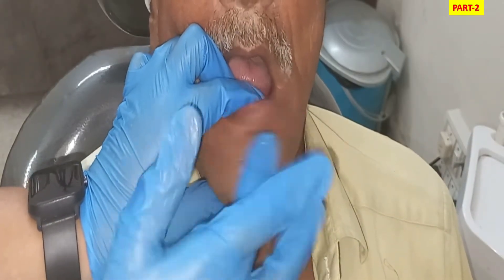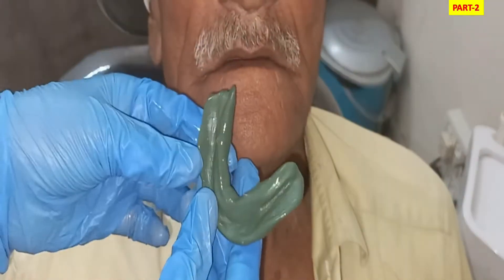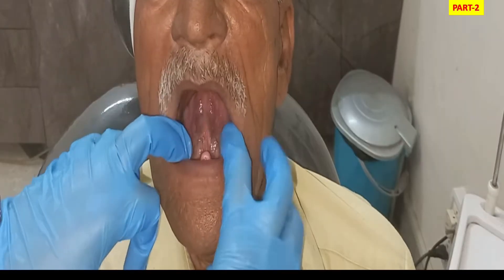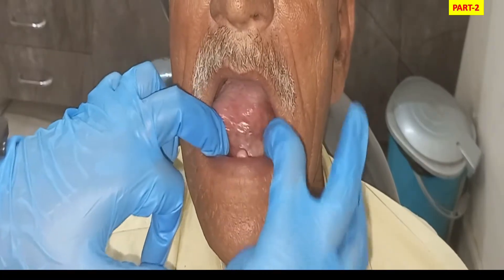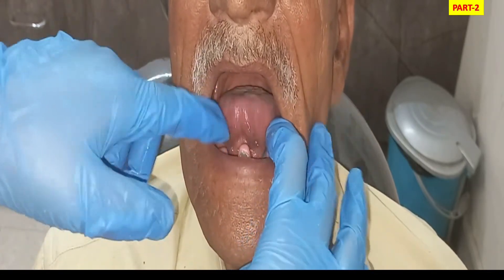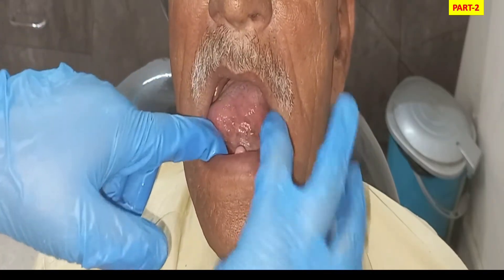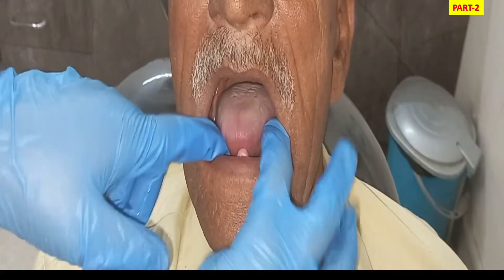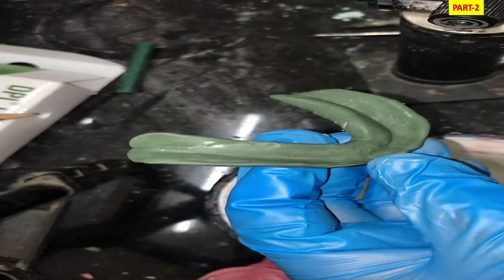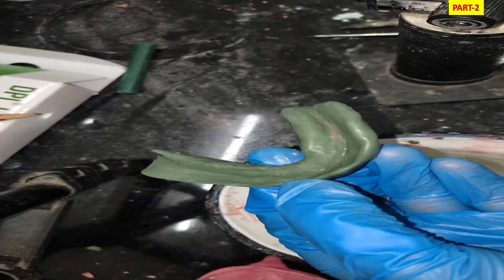After trimming the excess and refining, we perform all lip, cheek, and tongue movements again so that all borders — including the frenum and sulcus — are correctly recorded. Finally, we check stability by placing the tray in the patient's mouth and applying pressure on the premolar or molar region. If the other side of the tray rises, it indicates instability. This gives us the final refined impression.